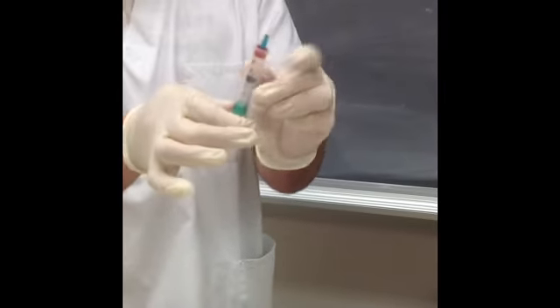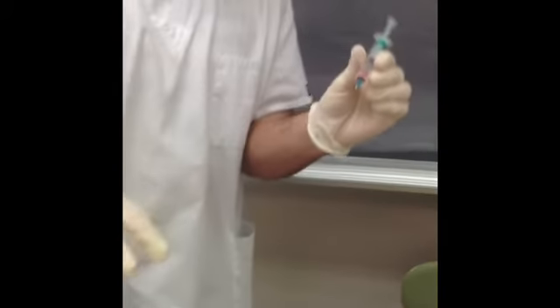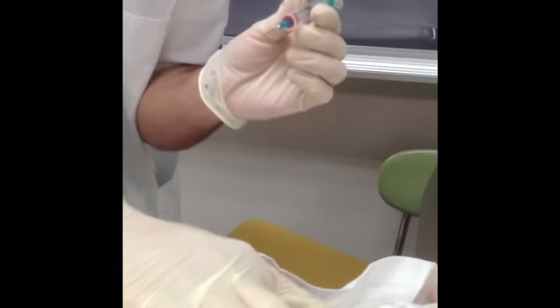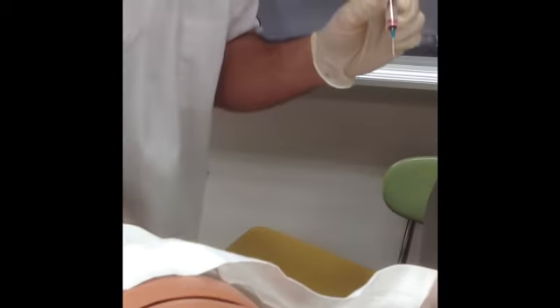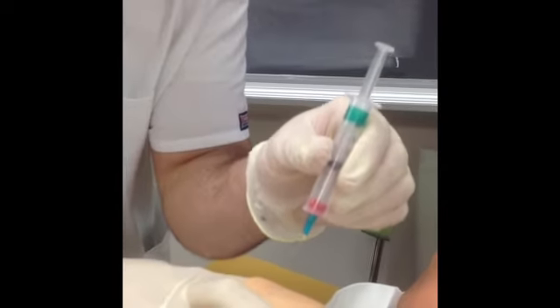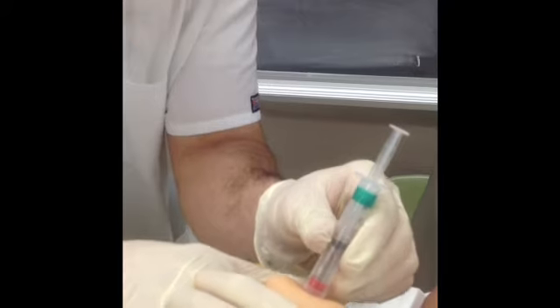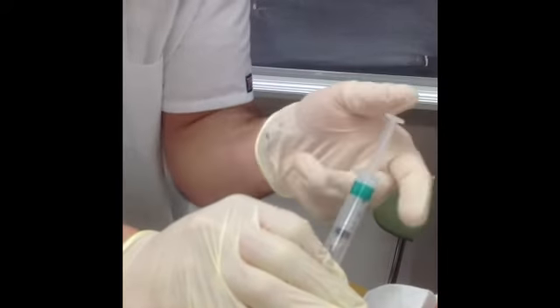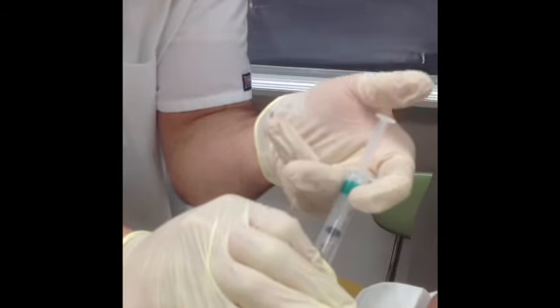Alrighty, so I allowed it to dry. So I'm going to uncap the syringe correctly. Okay. Now it's dried up, and now I'm going to find my markers again. I'm going to inject at a 90-degree angle. Okay. I'm going to aspirate to make sure there's no blood, because if there is, it's in the blood vessel, and that's not what you want. You've got to start right over.